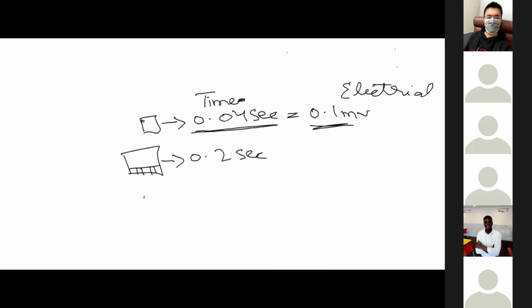And after that, do read the paper speed and voltage used. Normally the ECG is done at a speed of 25 millimeter per second with a voltage of 10 millimeter per 1 millivolt. This is important.